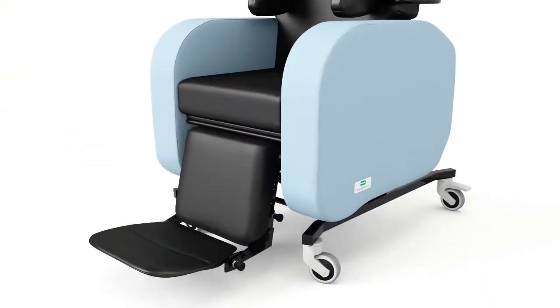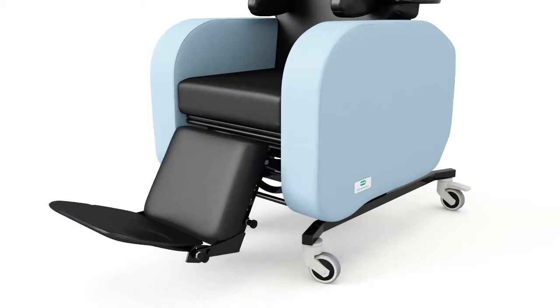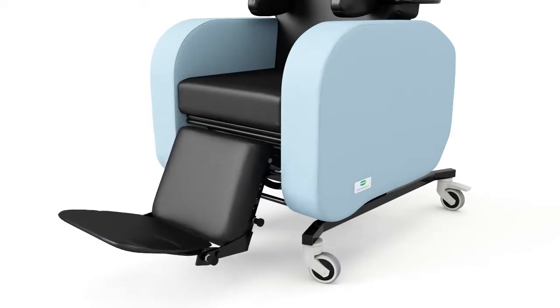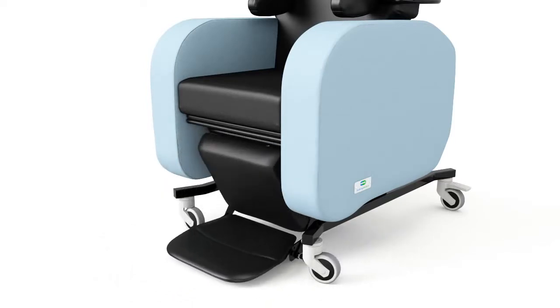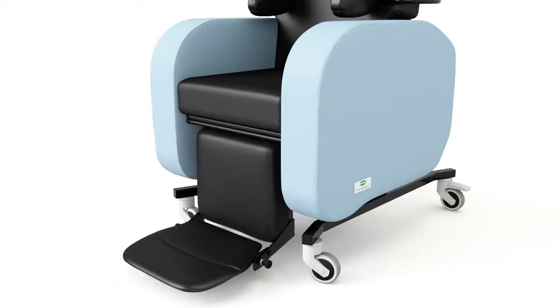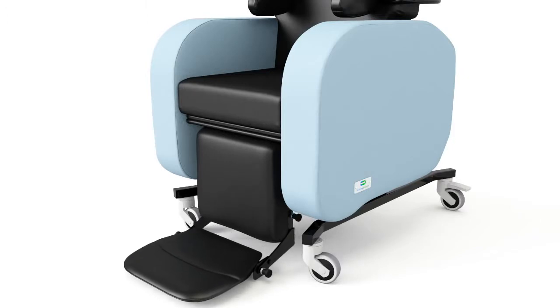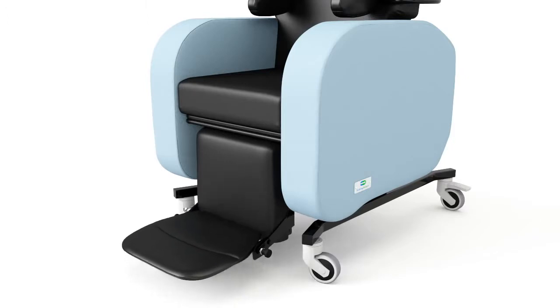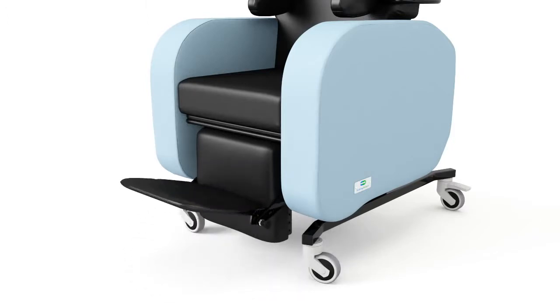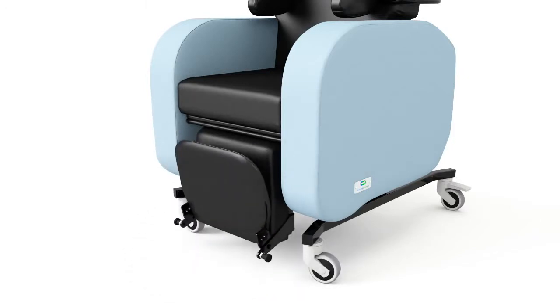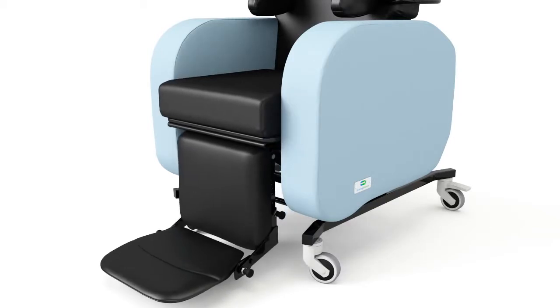The leg rest on the Phoenix not only elevates but has a unique negative angle adjustment to accommodate tight hamstrings while incorporating height and angle adjustable foot plates with fluid seat depth adjustment.